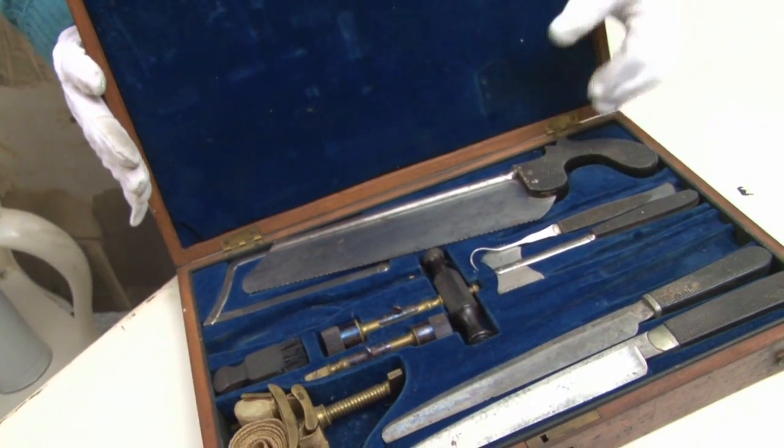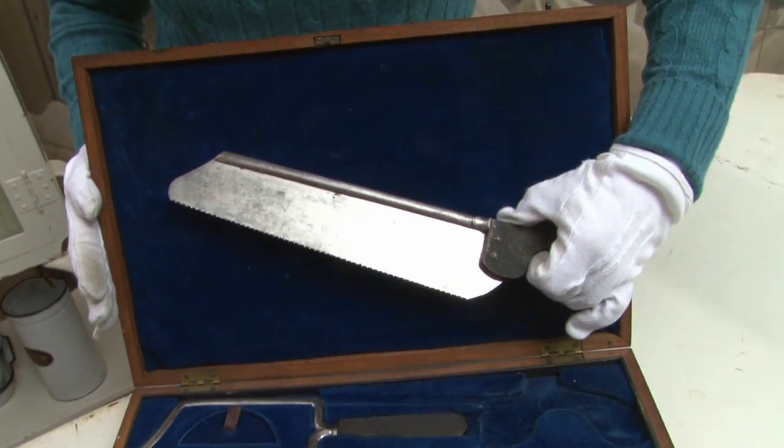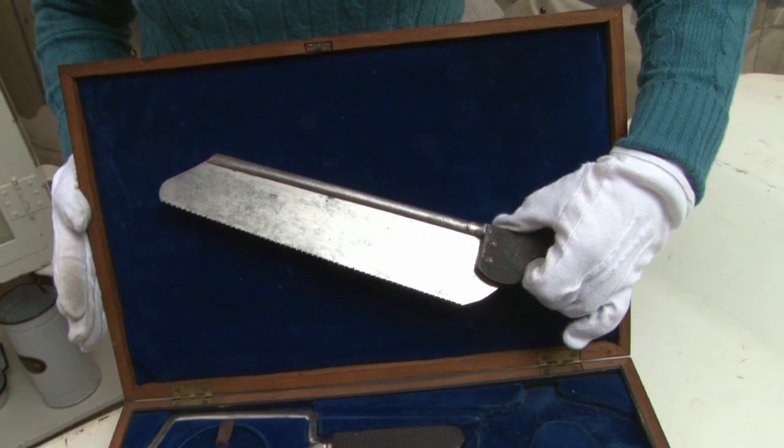This kit was made in the 1840s or 50s by J. H. Gemmering. He started out as a cutler making silverware. That was a common transition to the medical instrument field before the time of machine-made tools. This kit was sold for about $36 in the 1850s — that's about $1,000 today.